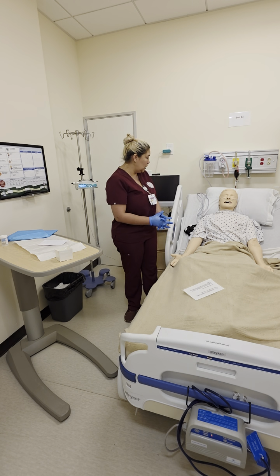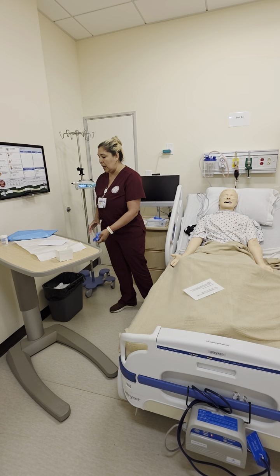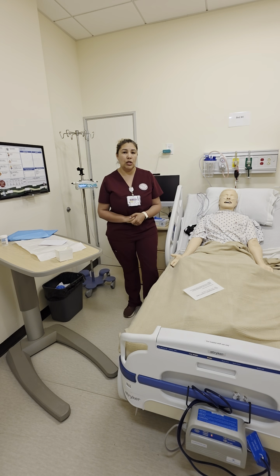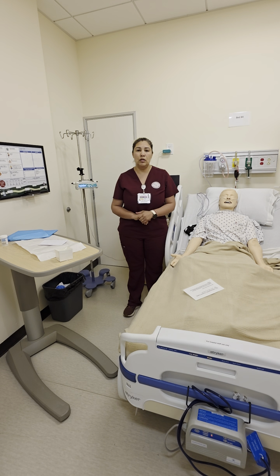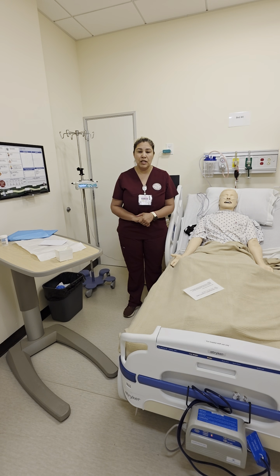And then my patient's comfortable, I'm going to take off my gloves, perform hand hygiene. I'm going to document the outcome of the procedure in the MAR, and I'm going to document the characteristics of the sputum. And I am all done with the procedure.